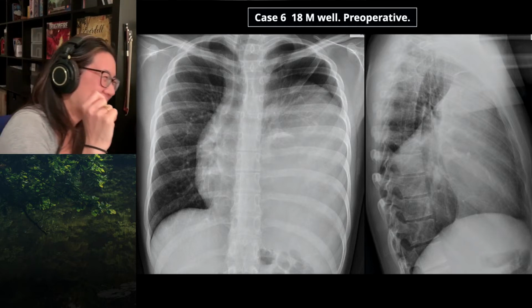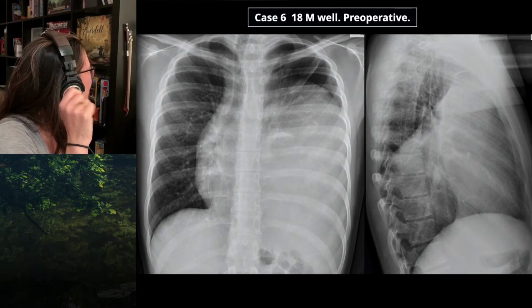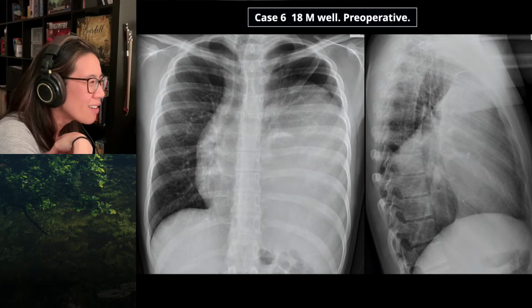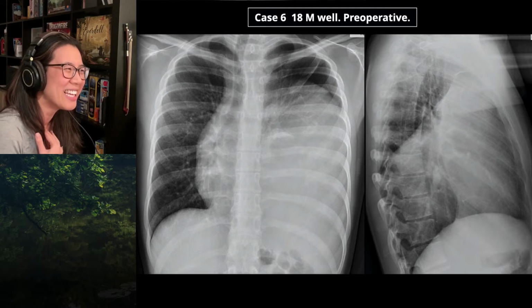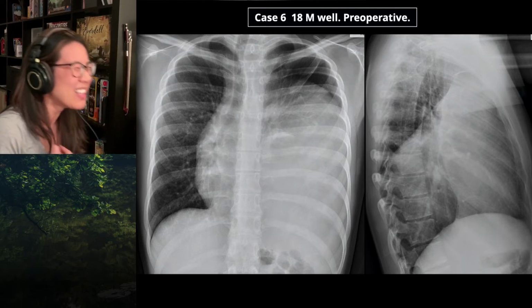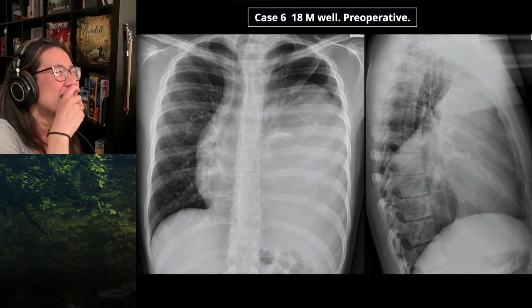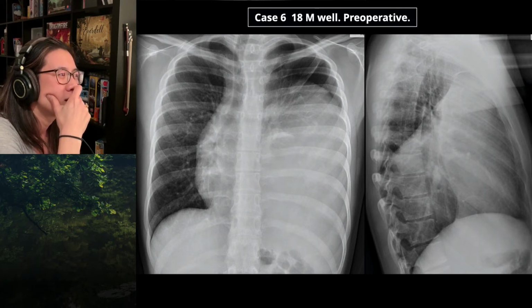The bit above the manubrium is called the superior trachea. Stick your finger on your sternal notch. What's above your sternal notch? Above my sternal notch is my, well, now hold on, you lost me, Bob. Your neck and your head. It's the cervical portion. So the cervical trachea is displaced, not just the mediastinal trachea. So despite a huge mass in the chest, it's probably also going up into the neck, into the base of a mass in the neck.